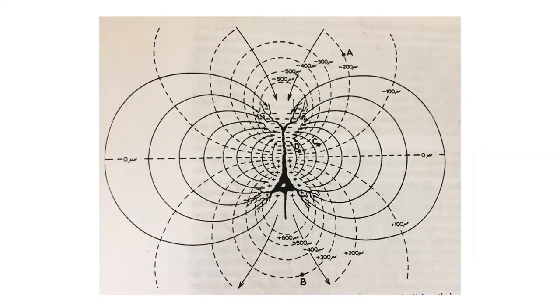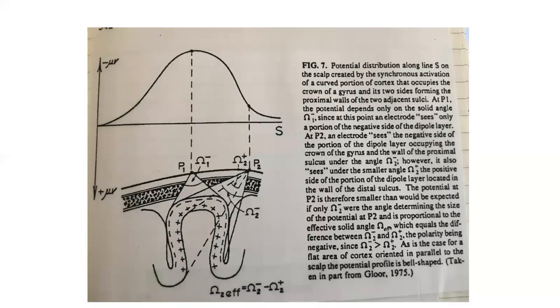The pair of electrodes at which the largest potential is recorded is not always closest to the area of the brain that generates that potential. The brain is a lot more convoluted than just a simple coin-like structure. What we're really seeing is different gyri.